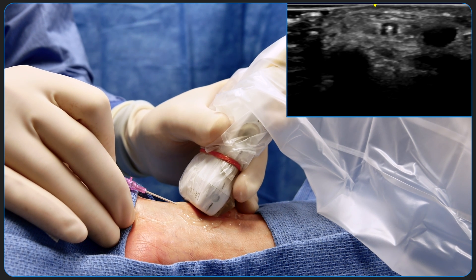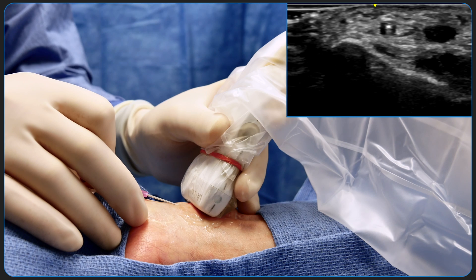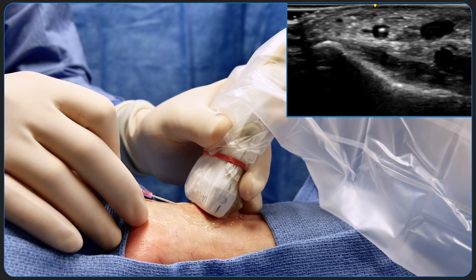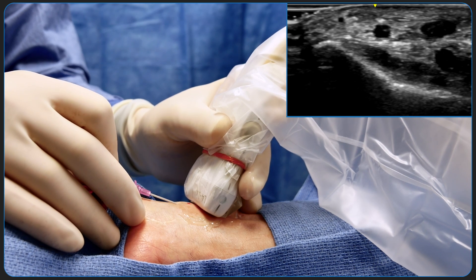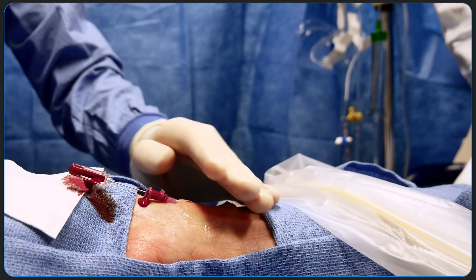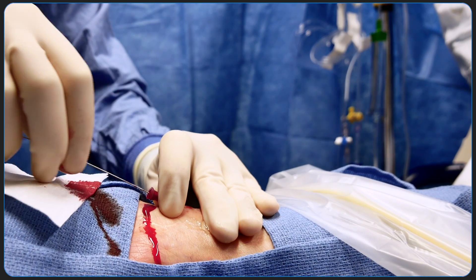The process of visualizing the body of the bevel, translating the ultrasound proximally to visualize the tip, and advancing the angiocath to again visualize the body is repeated to guide the angiocatheter into the vessel. Now the catheter can be threaded off into the vessel. The spring wire guide is inserted through the catheter to allow for exchange for a longer 3-inch indwelling catheter via the Seldinger technique.